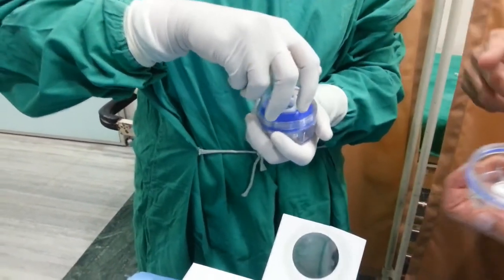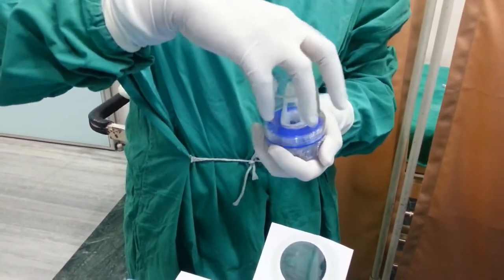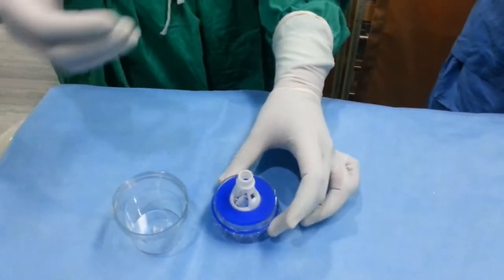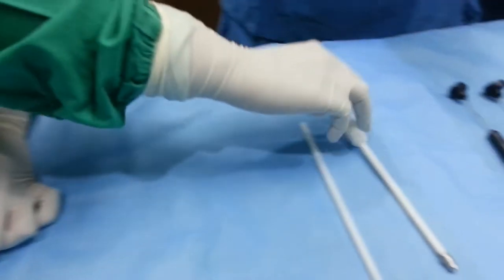After that, she unscrews it. That's now all a sterile procedure. She unscrews it and puts it away on the sterile trolley. Right? And takes the holder. No, she keeps holding in the left hand. She doesn't leave it. She takes the holder.